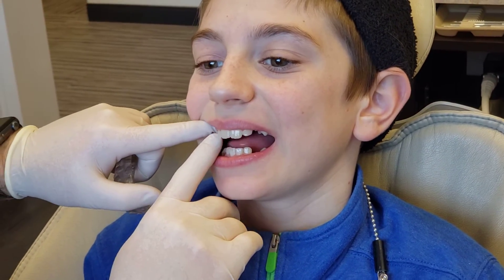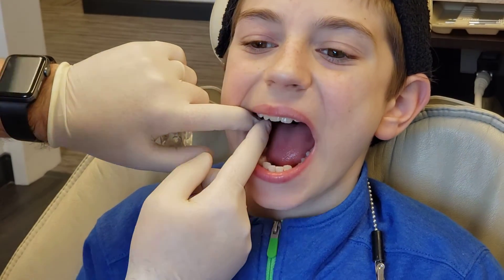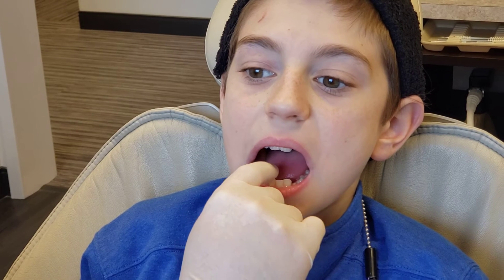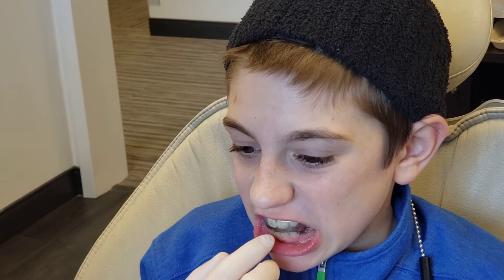This is the same tooth on the other side — that's the baby tooth. The permanent tooth will replace it. This tooth coming in back here is actually smaller than the baby tooth he lost, so as long as we're holding things, he has room for them to come in and the crowding will eventually resolve itself. I want you to be able to keep the top and bottom teeth in the tray — remember, squeeze for 10 seconds.